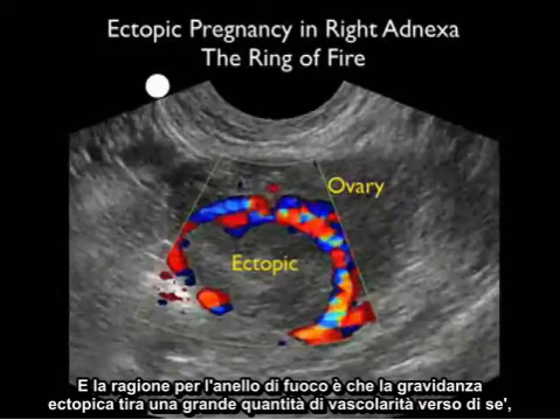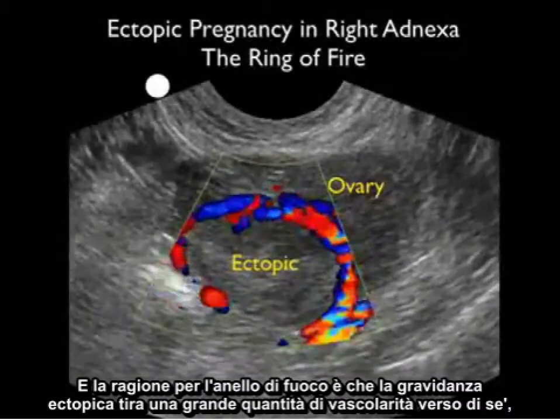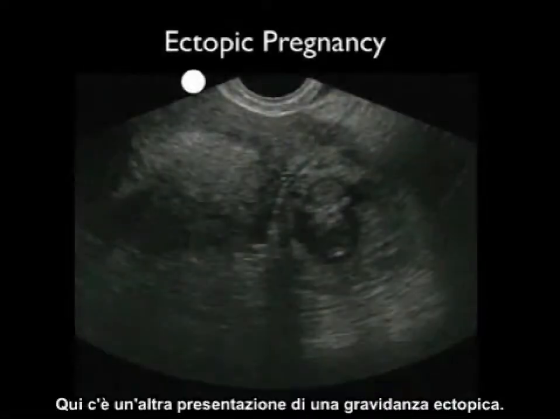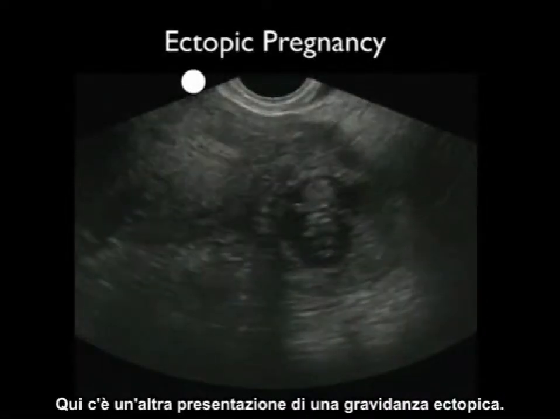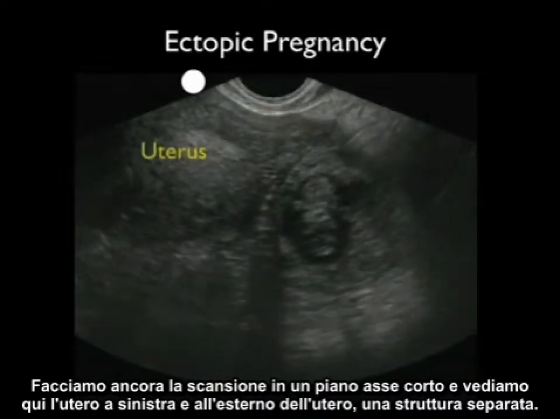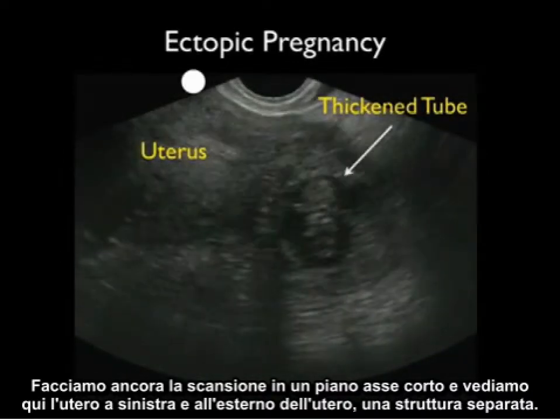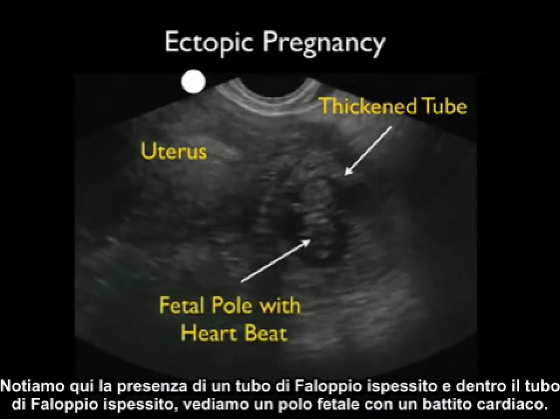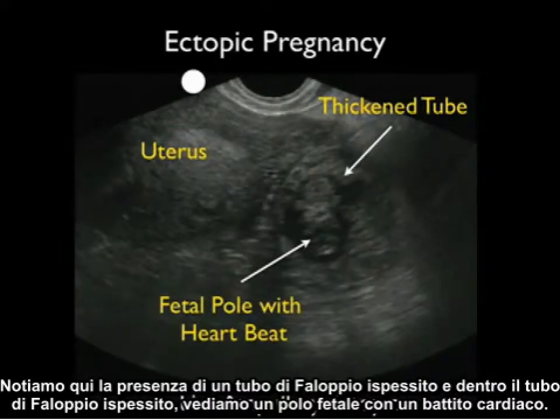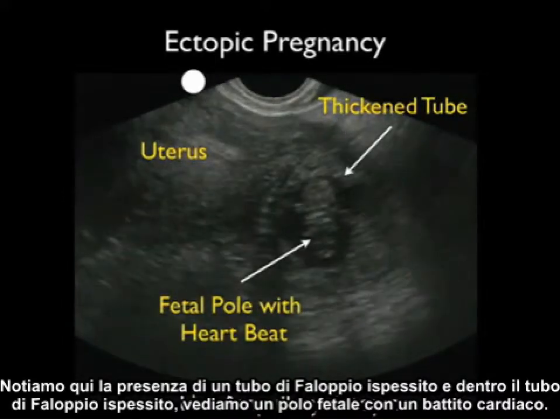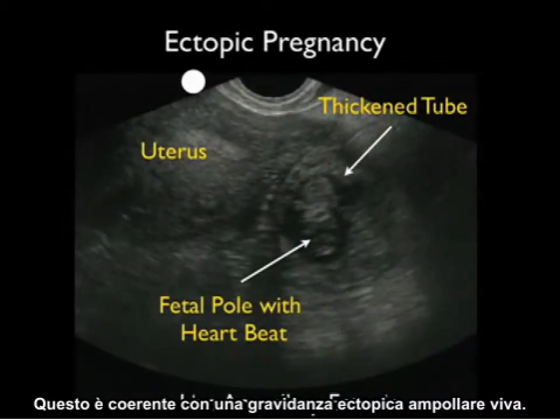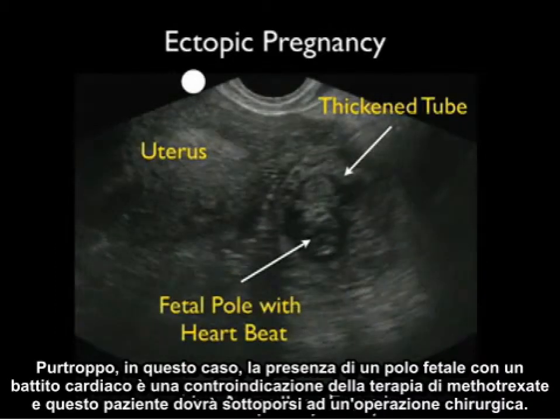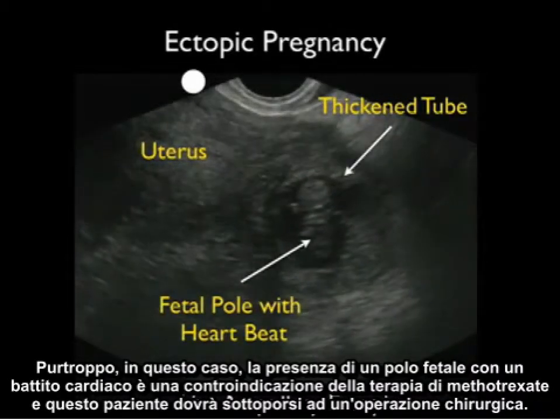The reason for the ring of fire is that the ectopic pregnancy pulls a huge amount of vascularity towards it, and using Doppler we can separate the ectopic from the ovary above it. Here's another presentation: scanning at a short-axis plane, we see the uterus to the left and outside it a separate structure — a thickened fallopian tube containing a fetal pole with a heartbeat, consistent with a live ampullary ectopic pregnancy. The presence of a fetal pole with a heartbeat is a contraindication to methotrexate therapy, and this patient will need to undergo surgery.